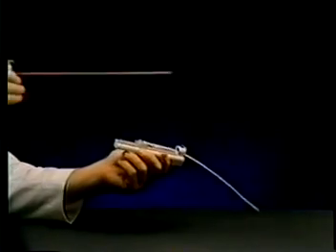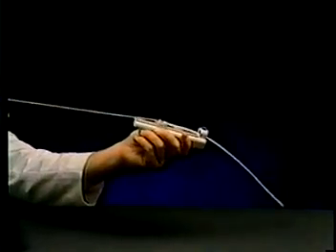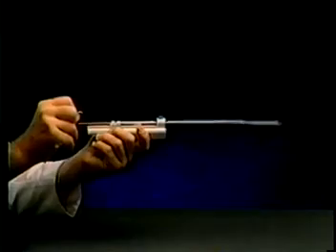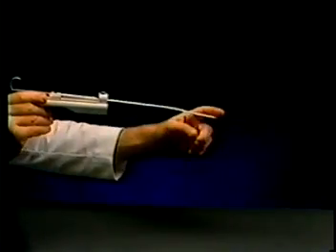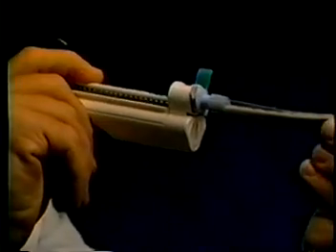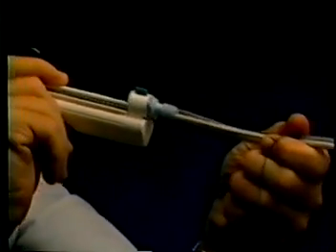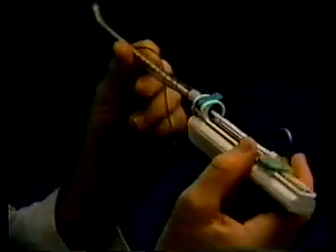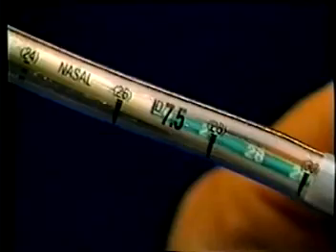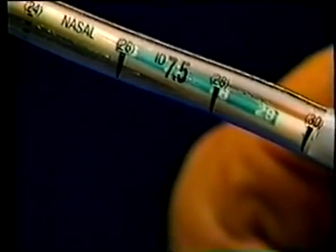Included within each wand is a specially designed intubation stylet. This stylet, which stiffens the wand, can be partially retracted to create flexibility at the tip. A clamp on the front of the handle accepts the 15 millimeter fitting on standard endotracheal tubes. Centimeter markings are printed on the wand; when these are aligned with the numbers on the tube, the bulb will be positioned at the tube tip.